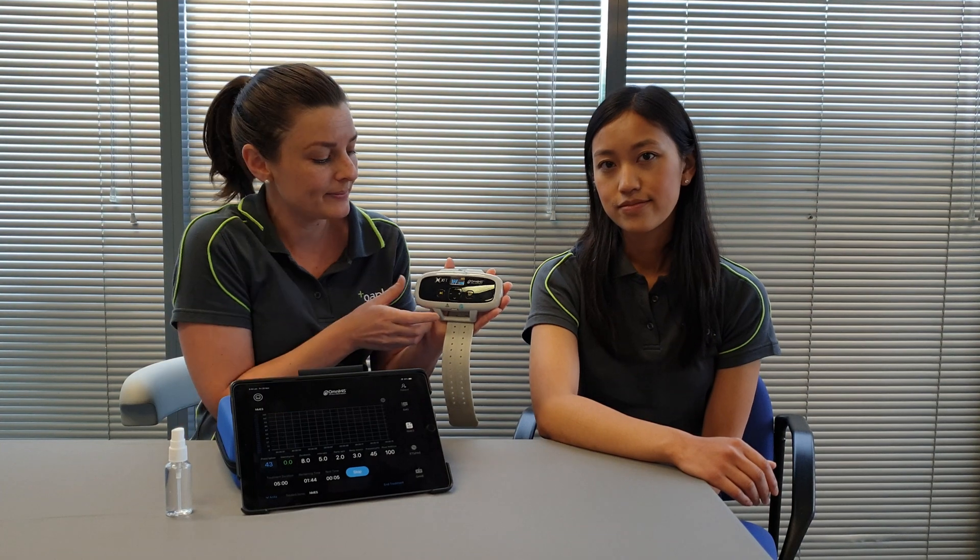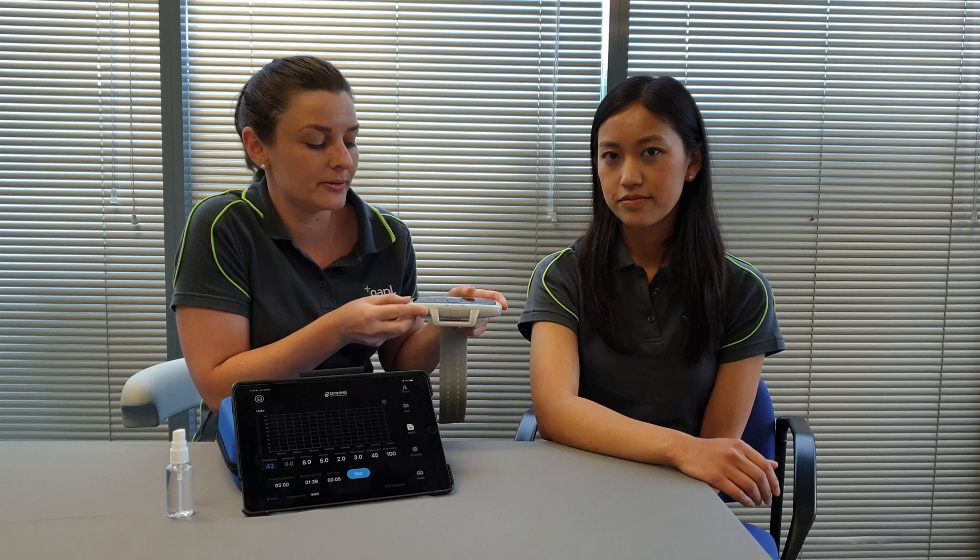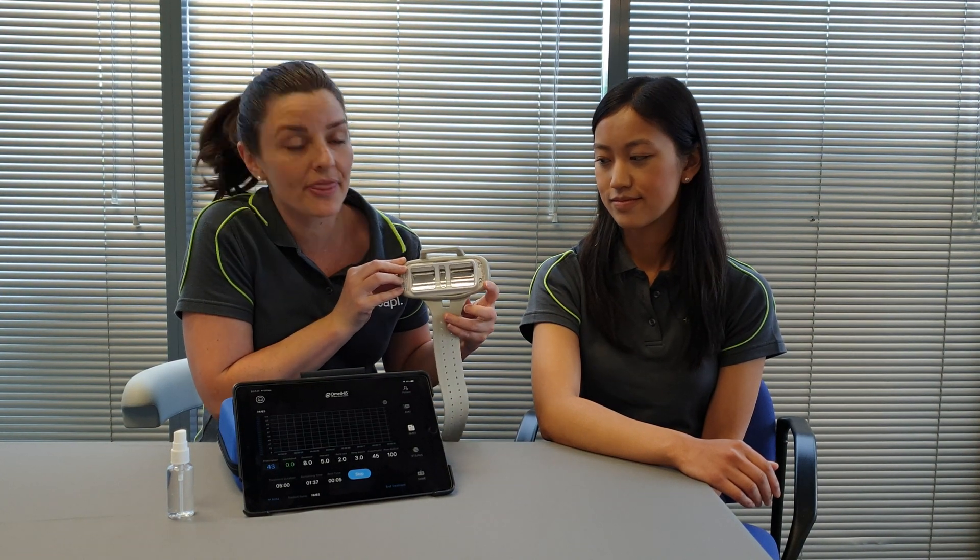You can see here that it comes with an LED screen for patients to read really easily, along with a selection of buttons, and here you can see there are three main stainless steel medical grade electrodes.